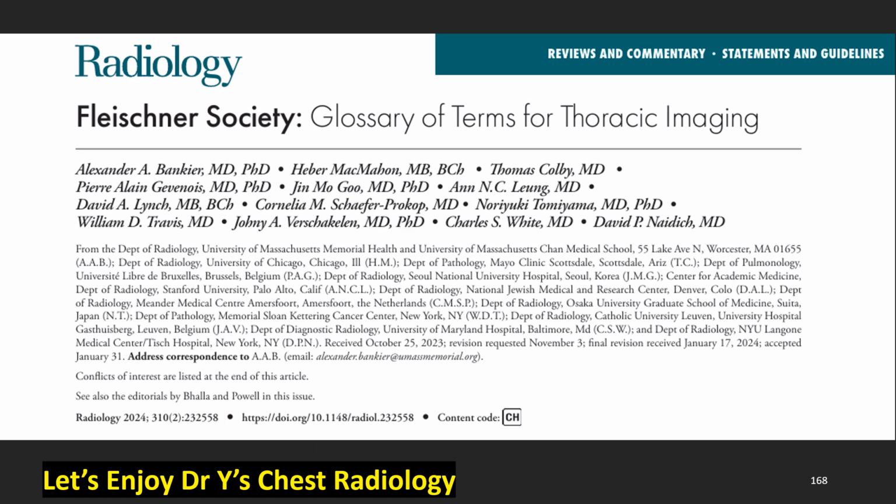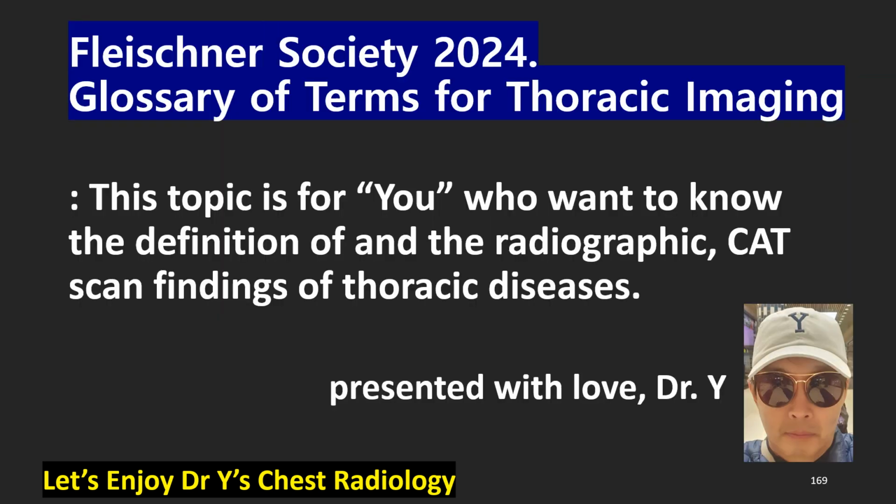This topic is based on the radiology reviews and commentary, statements and guidelines, Fleischner Society Glossary of Terms for Thoracic Imaging by Alexander A. Bankier et al., Radiology 2024, 310. This topic is for you who want to know the definition of and the radiographic CAT scan findings of the thoracic diseases.